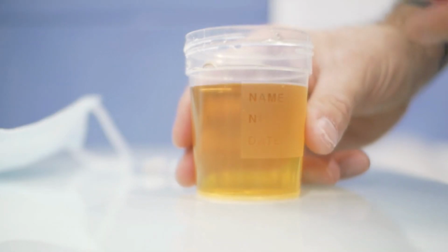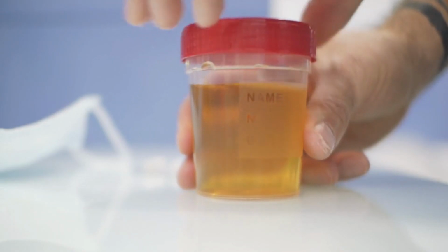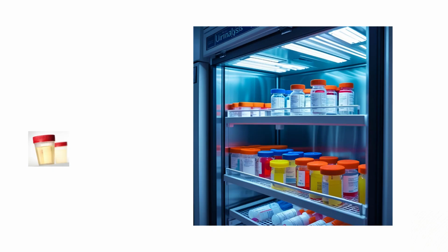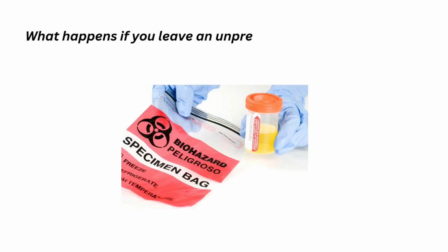In the outpatient setting, the patient usually collects. In the hospital, the nurse usually collects. If it's not possible to test within 2 hours, then it's best that we refrigerate the specimen.